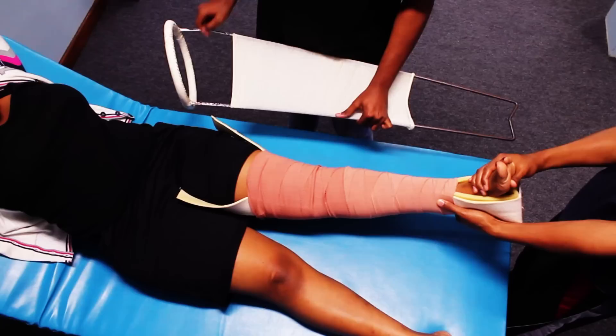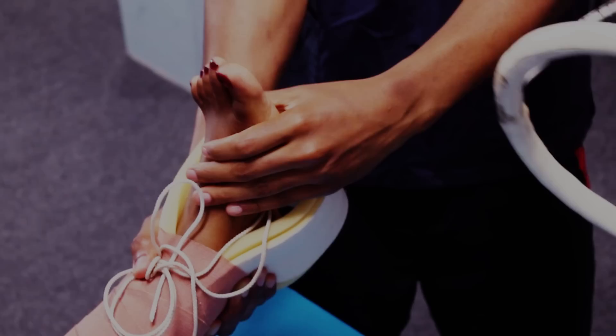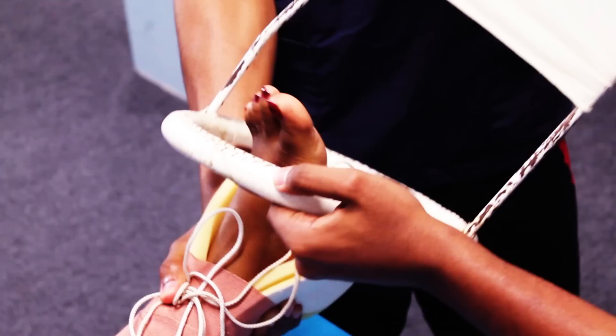This is the orientation in which the splint should be inserted, with the ischial tuberosity sitting on the rim. You should not insert it the other way because it becomes ineffective and predisposes to pressure sores in the groin. With your assistant keeping skin traction, work together to insert the Thomas splint up to the level of the groin.